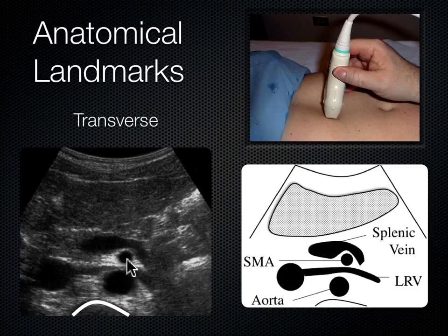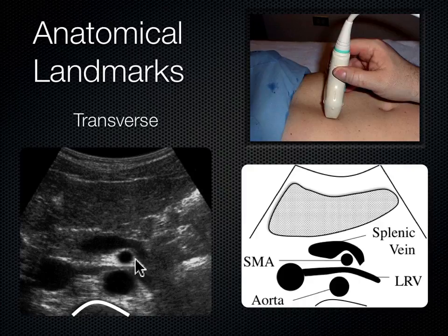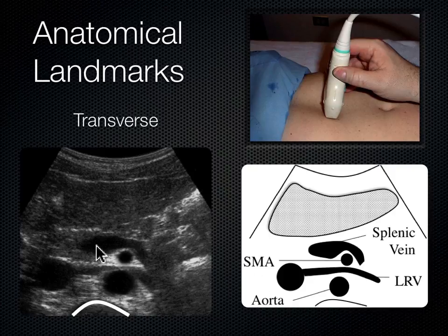Moving more anteriorly, the next vessel brings blood out to the intestines as a branch off the aorta — that's the SMA, or superior mesenteric artery, which looks like a mantle clock. Draped over the SMA is an anechoic structure — the splenic vein. The splenic vein takes blood from the spleen on the left side of the body, and it eventually combines with the superior mesenteric vein to form the portal vein, which empties into the liver.